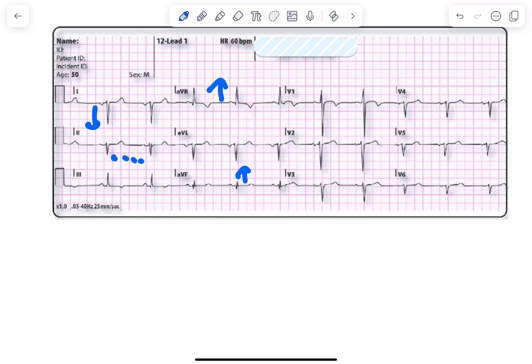Let's look at the axis. QRS is predominantly negative in lead I and positive in aVF, so it comes to right axis deviation because both are reaching each other.